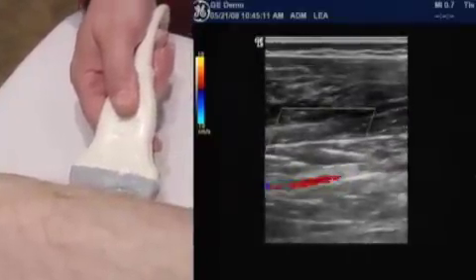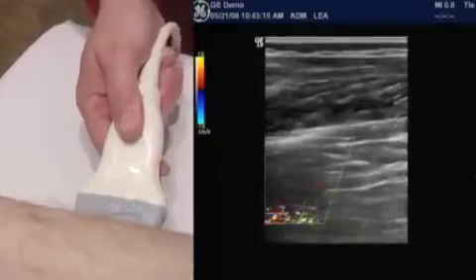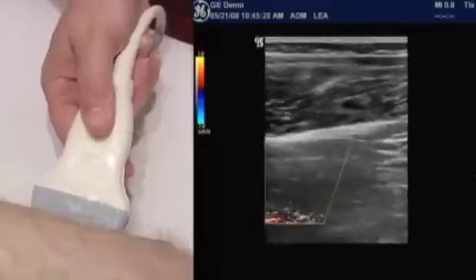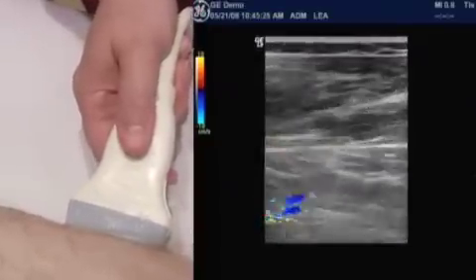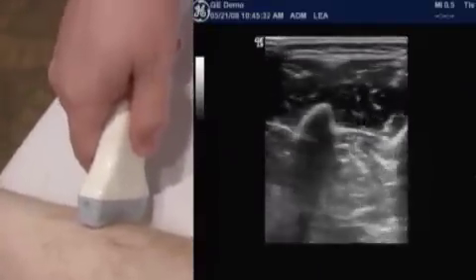I think as I turned him, some of the muscles got extended, some of the tendons a little bit, and it just sort of pushed things a little bit more out of view. Now we should be able to come up and follow it. We're still losing it a little bit here, so I'm going to see what I can follow more in transverse.